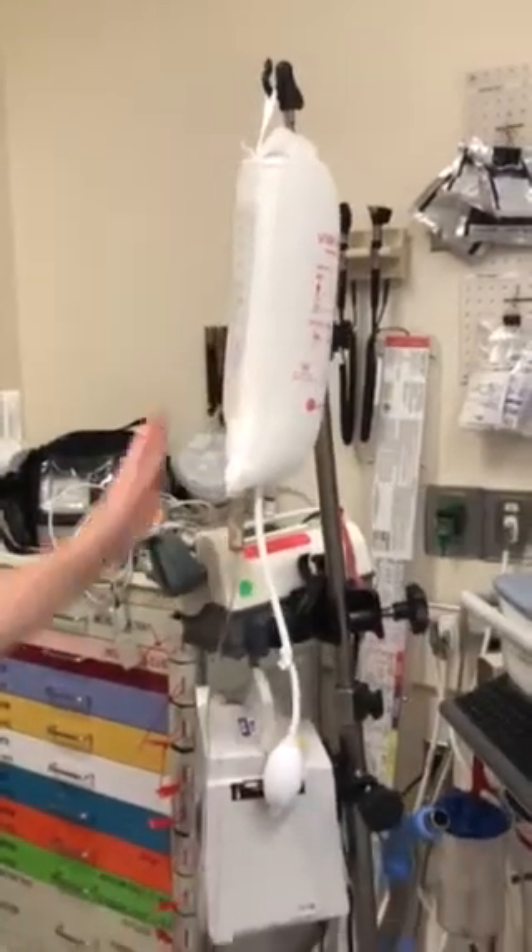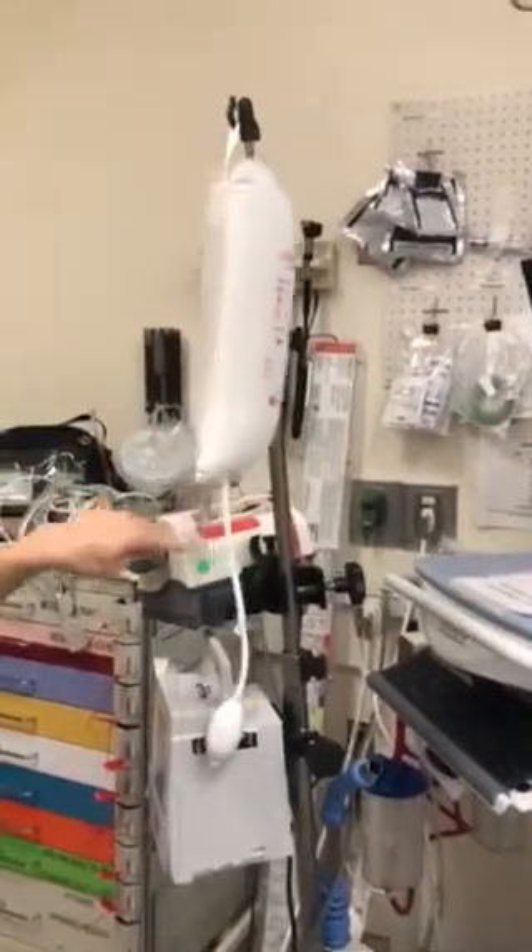Ideally, if you're giving a liter, it should go in within about 15 minutes if you are continuously maintaining the pressure.